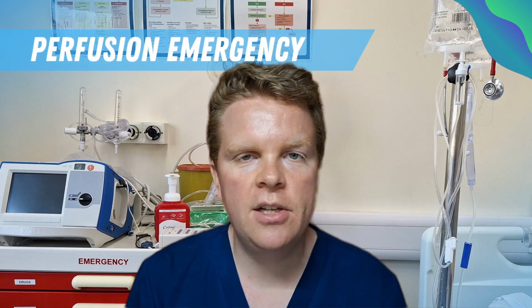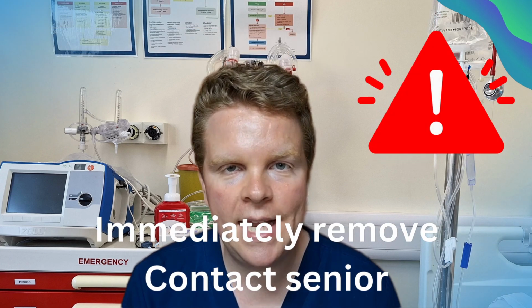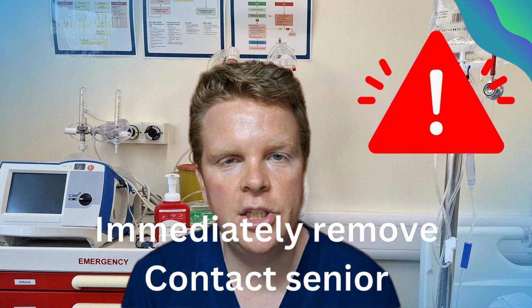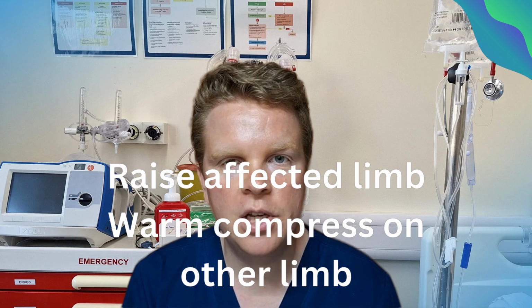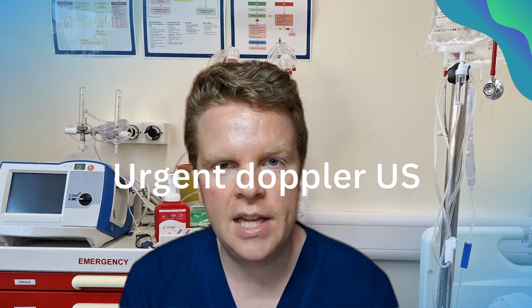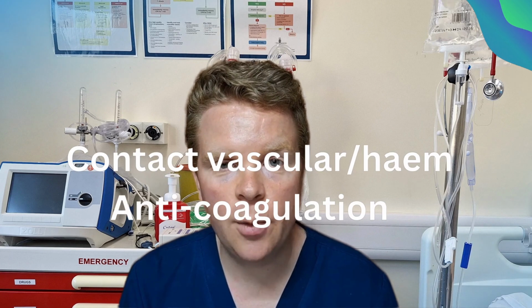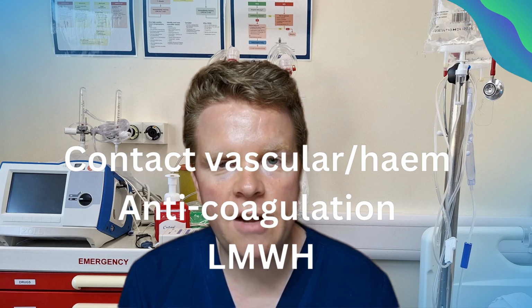What should you do if the baby suddenly develops severely reduced perfusion distally to the arterial line? Firstly, remove the arterial line immediately and contact a senior neonatologist. Raise the affected limb and put a warm compress on the contralateral limb to promote reflex vasodilation. Perform an urgent Doppler ultrasound to identify the cause. If this persists, consider anticoagulating and using low molecular weight heparin. Discuss with a haematologist and vascular surgeon before doing this.